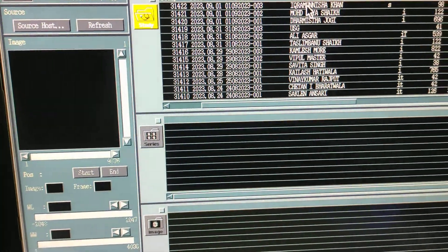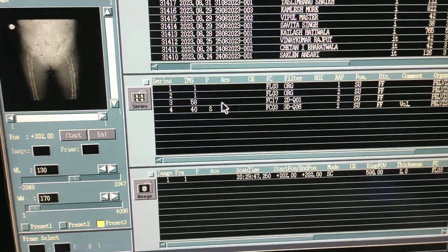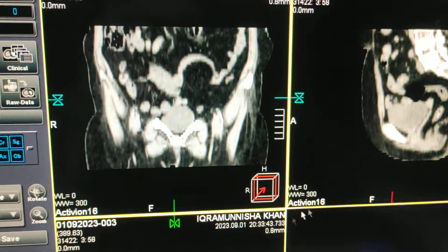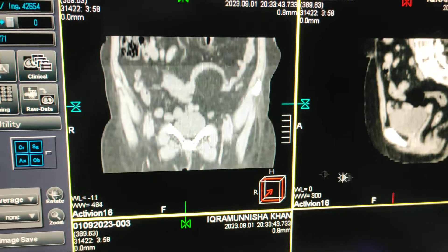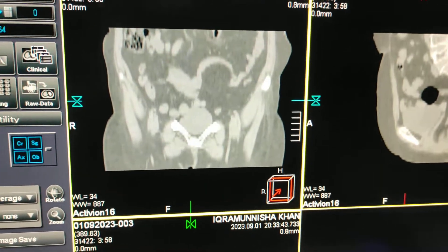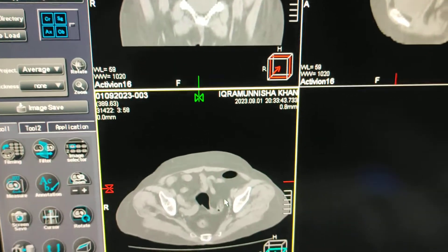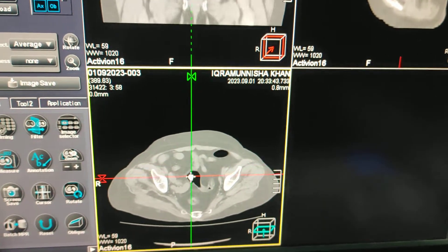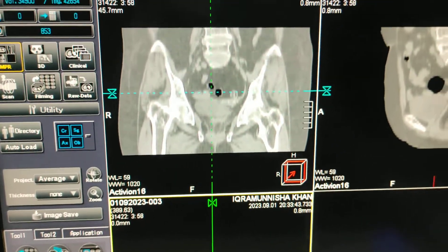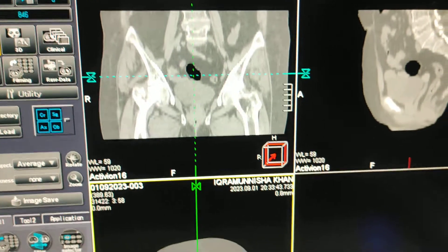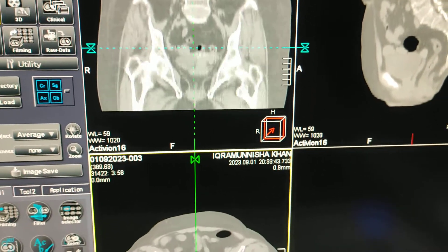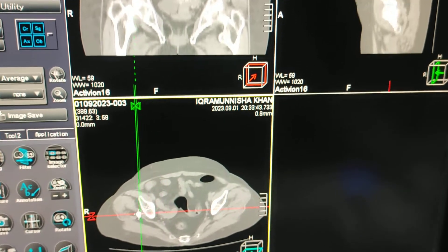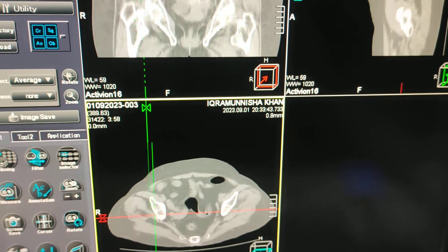I will enter the images into MPR to check whether there is any motion or not. This is not a final recon — it's just to check whether the scan is proper or not. This is just raw data; I will reconstruct afterwards and then show you what the parameters are for the recons.